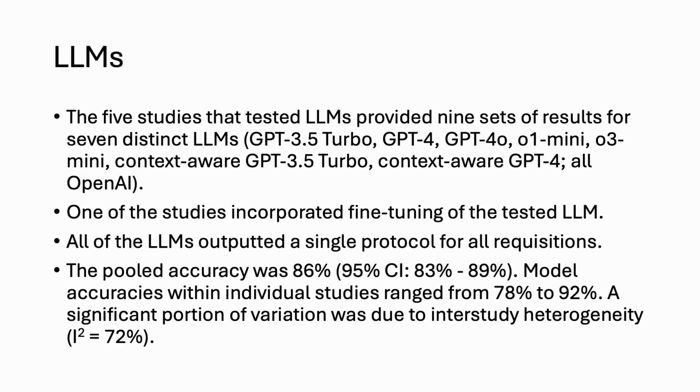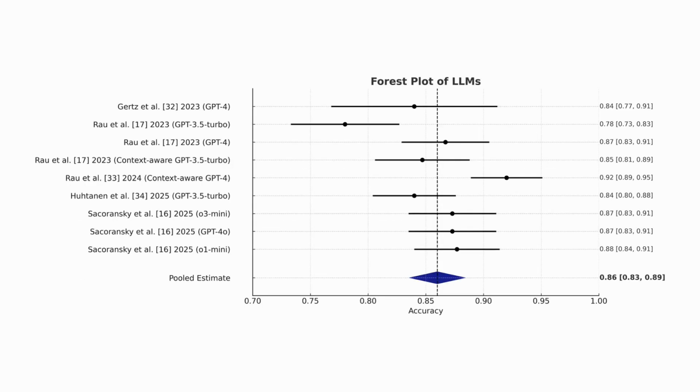In terms of LLMs, there were 5 studies that used LLMs for the protocoling task, and only 1 of 5 studies used fine-tuning. In terms of the pooled accuracy, it was 86%, which was slightly lower than the BERT models, but higher than the traditional machine learning models.